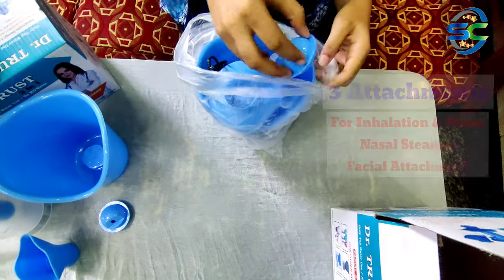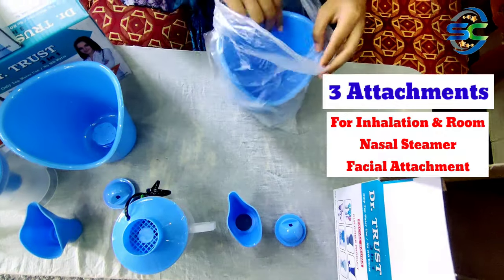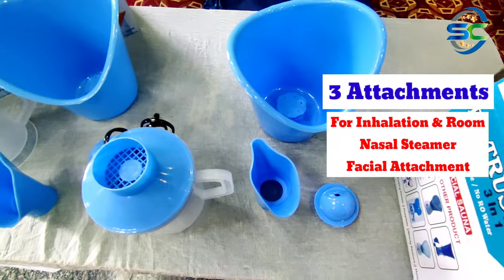It will be used in this way. There are three attachments. This one is for the entire face. The other attachment is for the nose.